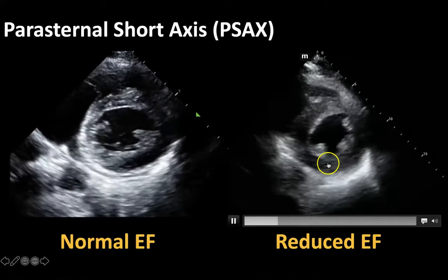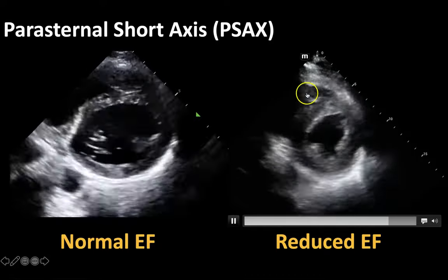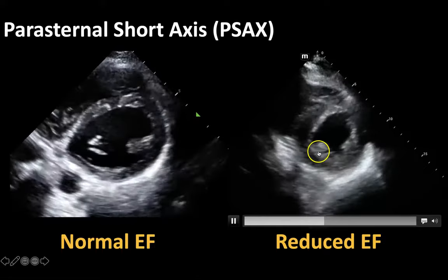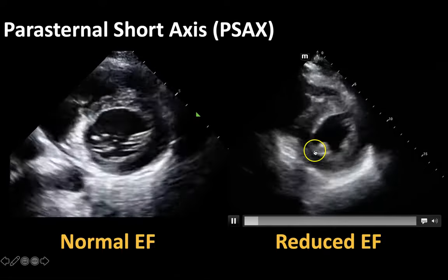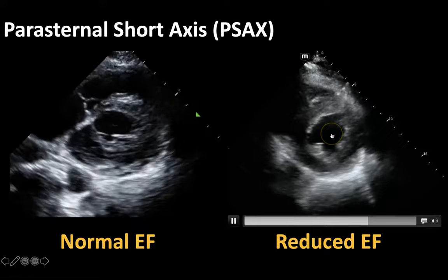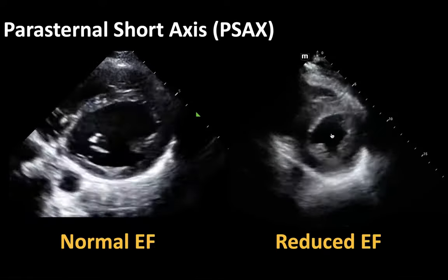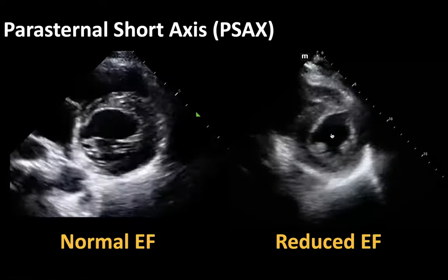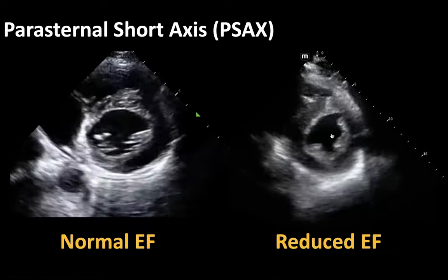This is the same cut — your parasternal short axis view — with your left ventricle and right ventricle, at the level of the papillary muscles. If you picture putting your finger in the middle of this ventricle, you'll see that the walls are really not coming anywhere close to it. This is certainly a heart with a reduced ejection fraction.